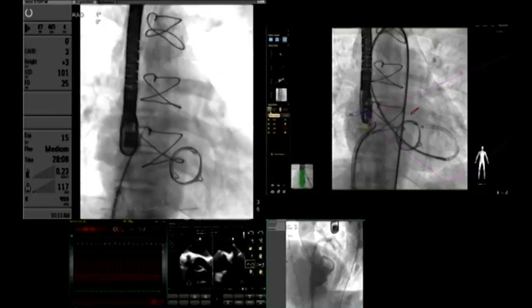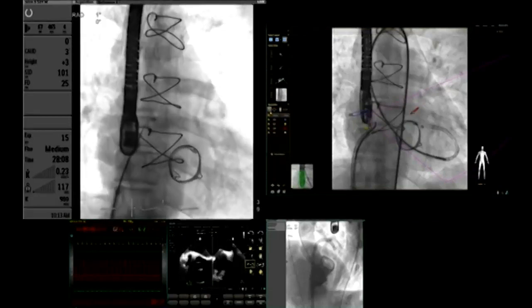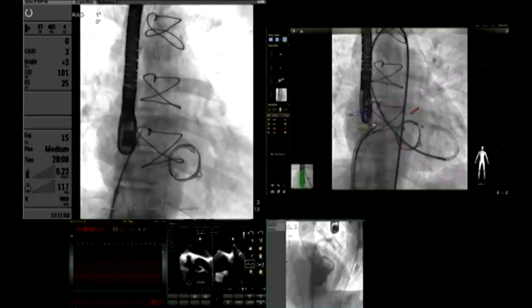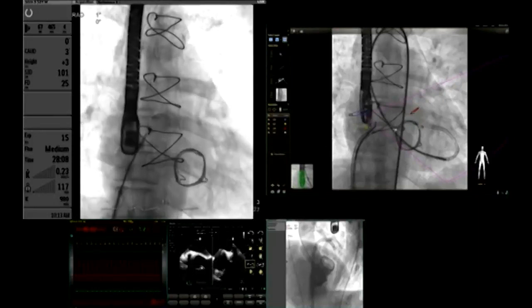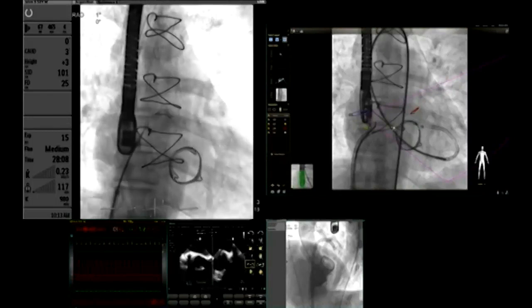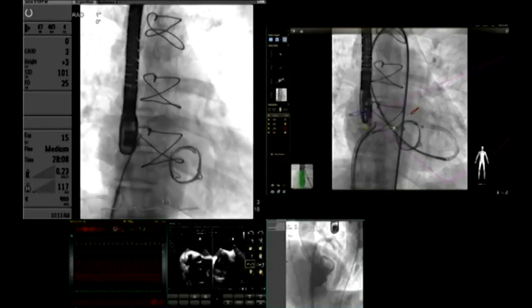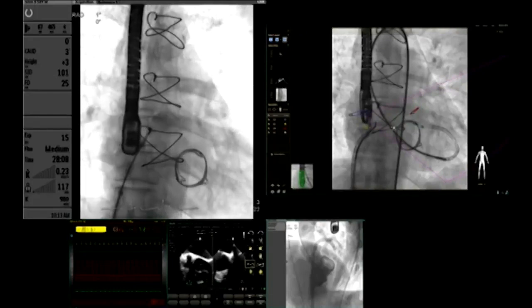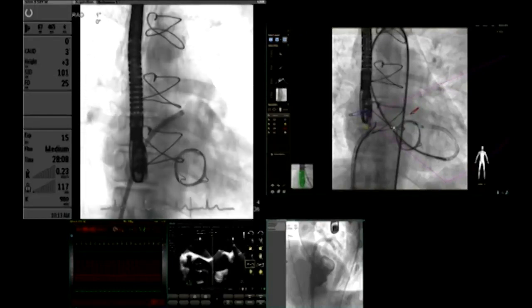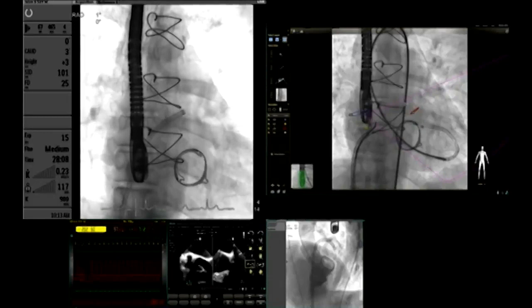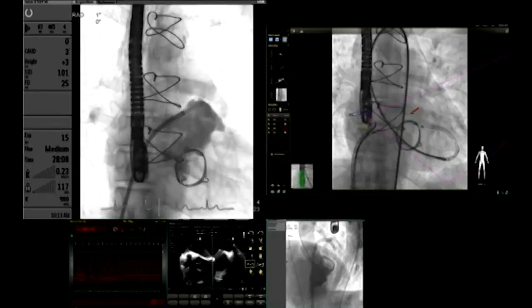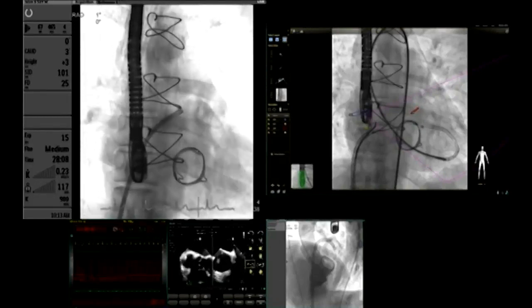This is the septal puncture as guided by echo. You can appreciate the position of the intra-atrial septum that we have marked — we are poking exactly in the same area on the leftward screen. We entered into the left atrium with the transeptal Brockenbrough needle and advanced it deep inside. Now you can appreciate on this screen the mouth of the left atrial appendage, and you can see the left atrial appendage getting lit up there.